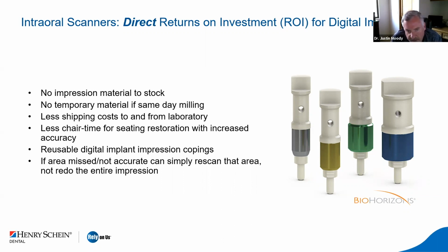And many of these impression copings are reusable, and that cuts down on the things that we have to continually purchase over time.